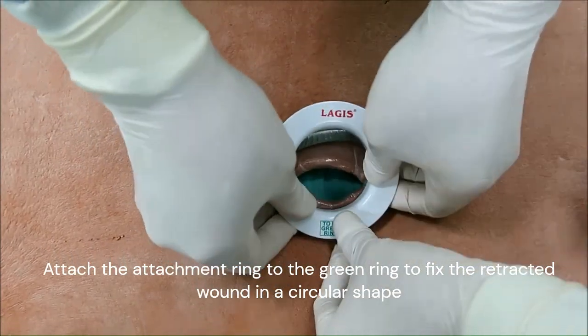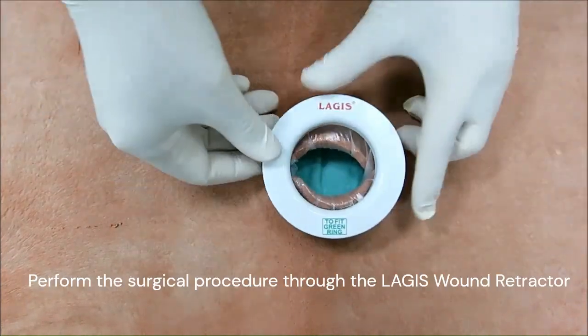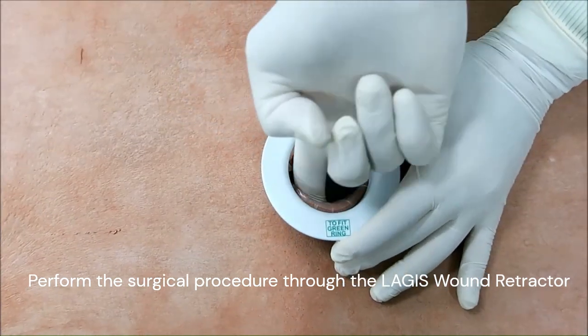Attach the attachment ring to the green ring to fix the retracted wound in a circular shape. Perform the surgical procedure through the LAGIS Wound Retractor.